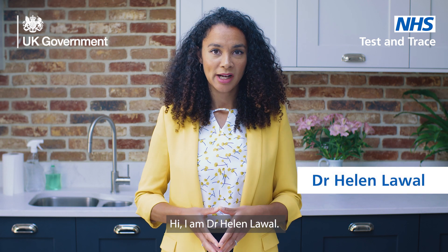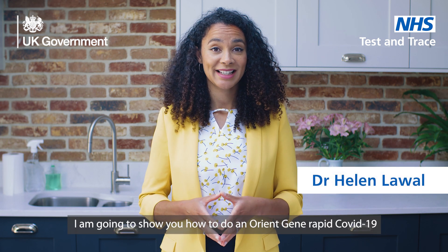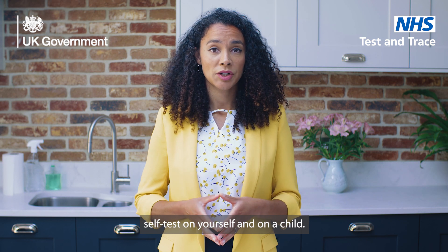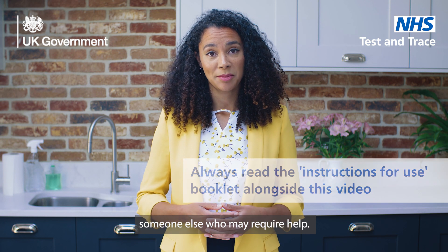Hi, I'm Dr Helen Lawal. I'm going to show you how to do an OrientGene rapid COVID-19 self-test on yourself and on a child. You can also use this guidance for testing someone else who may require help.